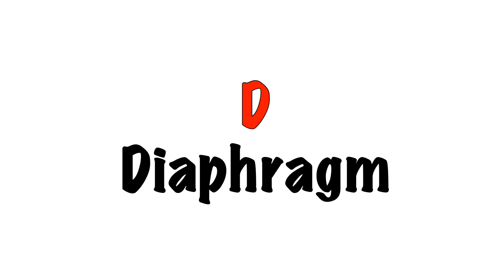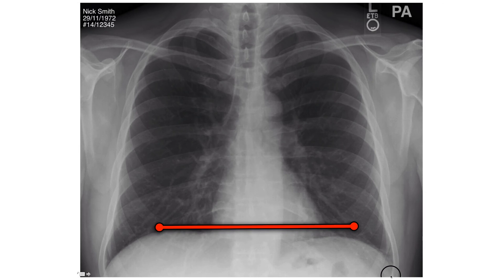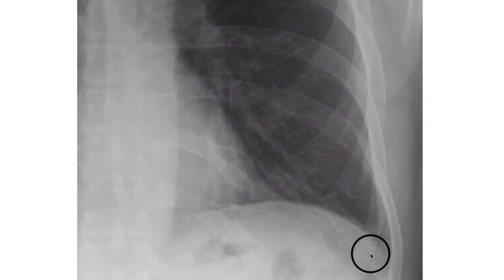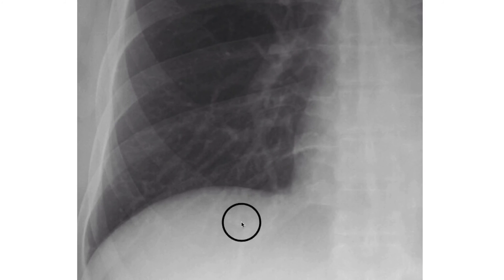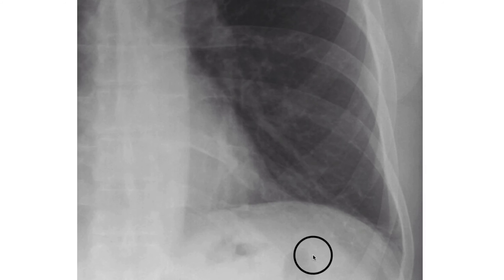D — Diaphragm. Each side of the diaphragm should appear as a dome with a sharp white edge against the adjacent black lung. The right hemidiaphragm is normally higher than the left by about 1–3 cm due to the liver underneath. The costophrenic angles are the areas where the diaphragm meets the ribs laterally. The cardiophrenic angle is where the heart meets the diaphragm. These angles should be clearly defined. Often, you will see the gastric air bubble under the left hemidiaphragm.